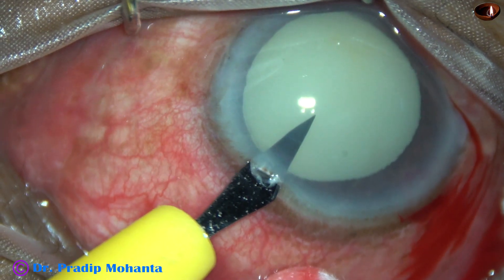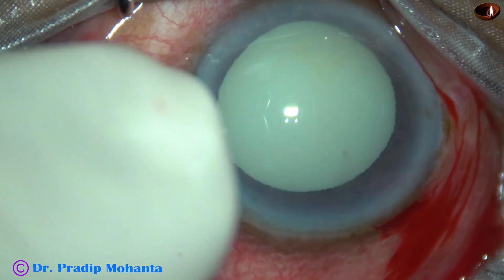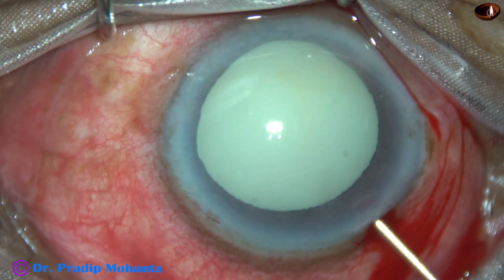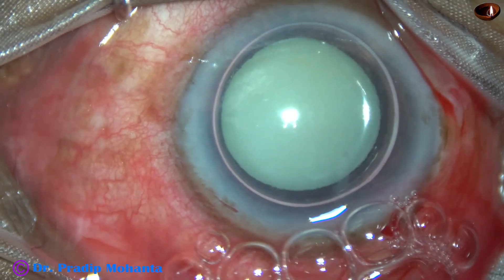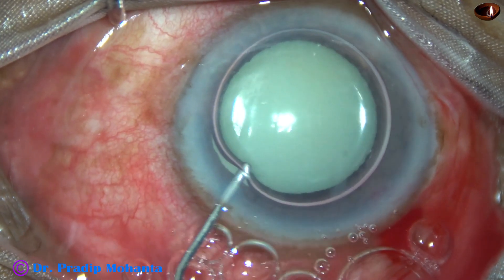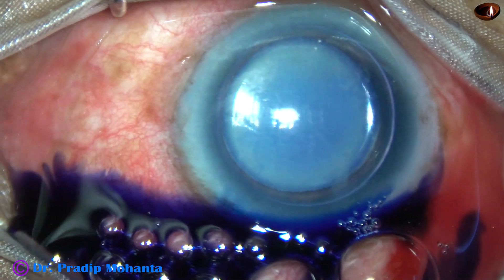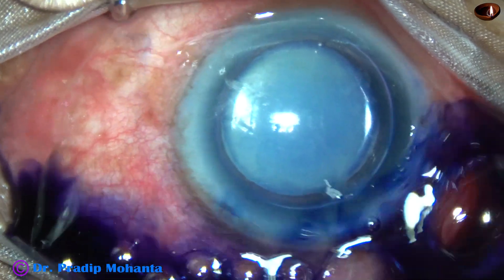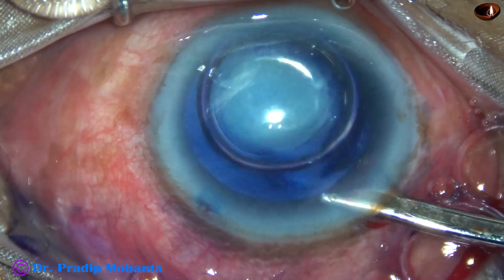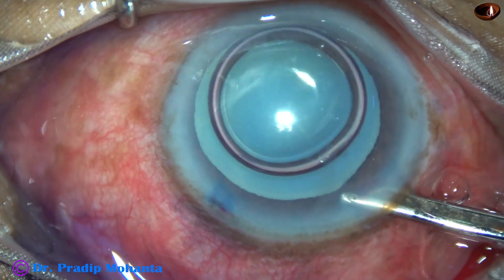By this time, the main incision has been made and a side port has been made on the left side of the main incision. And now an air bubble is injected. Beneath this air bubble, Trypan Blue dye is applied over the anterior capsule. And now the dye is washed out using a 23G Simcoe cannula and BSS.